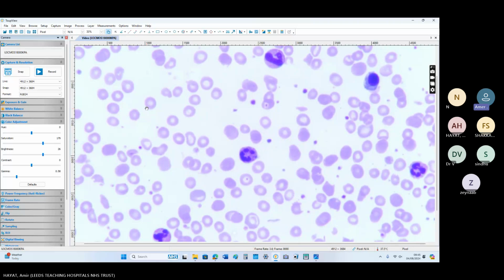You will mention that the patient needs further investigations to rule out different causes of MAHA, like sepsis. This patient has increased neutrophil count, so the patient would need cultures. You will not mention cultures, but you will say workup to rule out sepsis as a cause of MAHA, hemolytic uremic syndrome, drugs, malignancies, and so on.